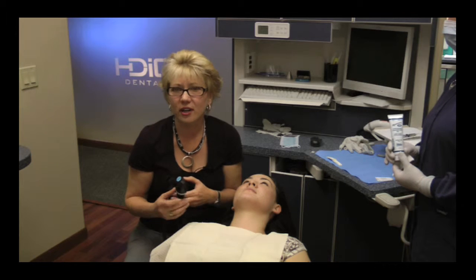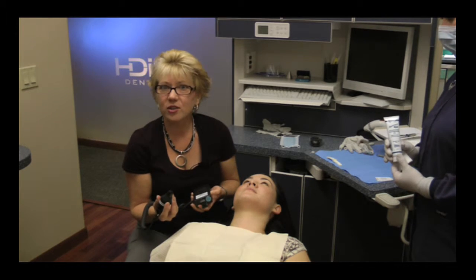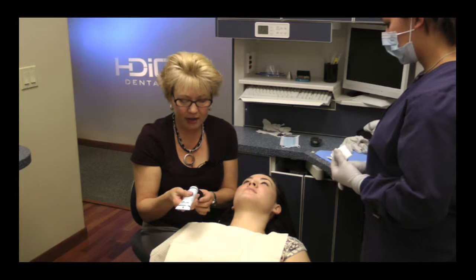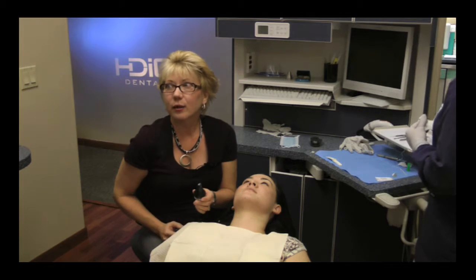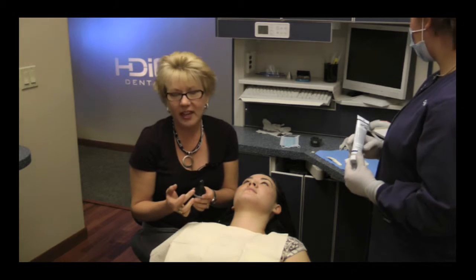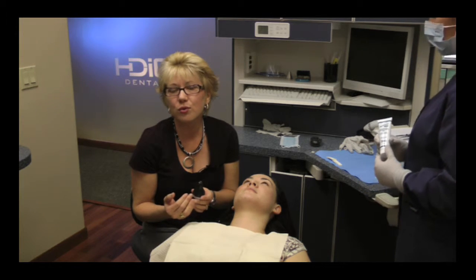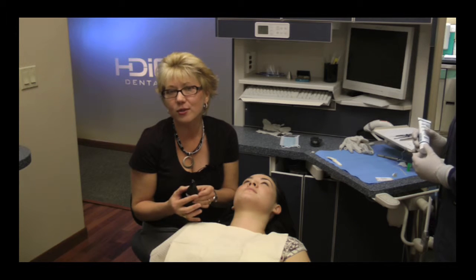So as we get started, first, I'm going to make sure the Doppler's on, but I turn the noise all the way down so it's not distracting. I actually put the Doppler jelly right onto the head of the Doppler. And as you can see, you want a really generous amount, okay? It's really critical that the actual head of the Doppler never touch Katie's skin, that the sound is being communicated through the jelly. So I need at least a good 1/4 inch of that between her skin and the head of the Doppler.